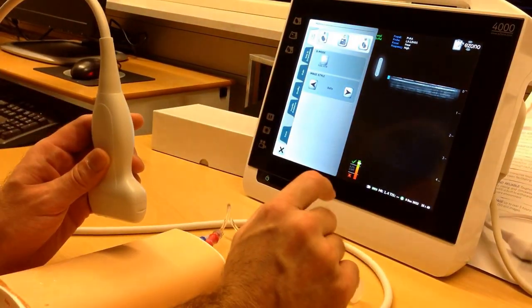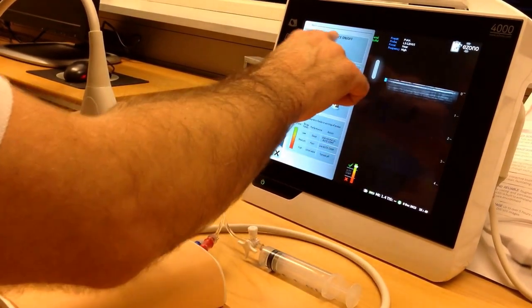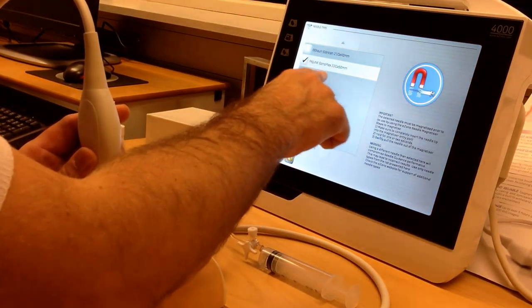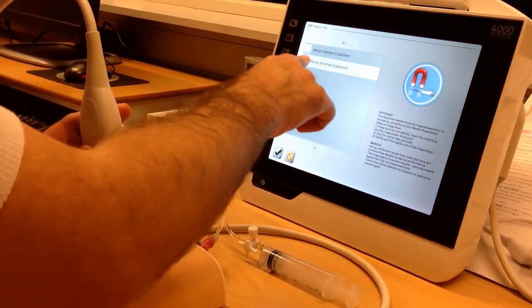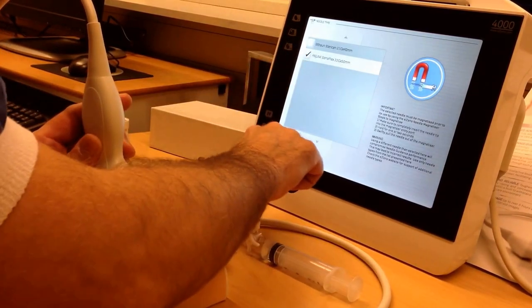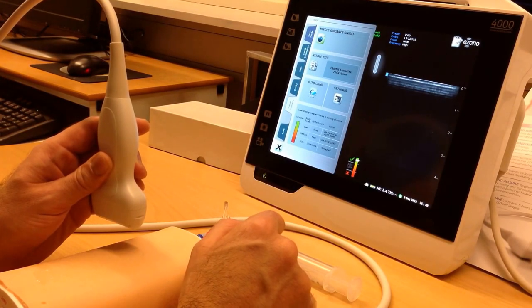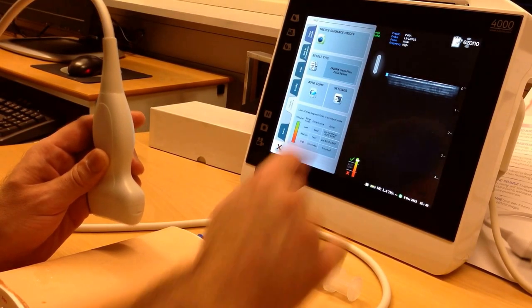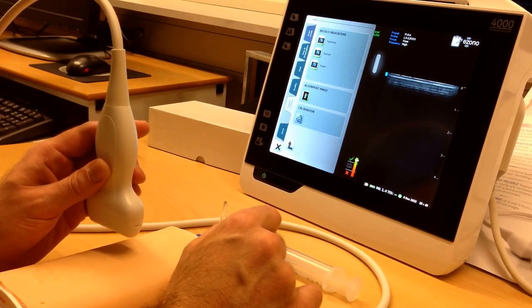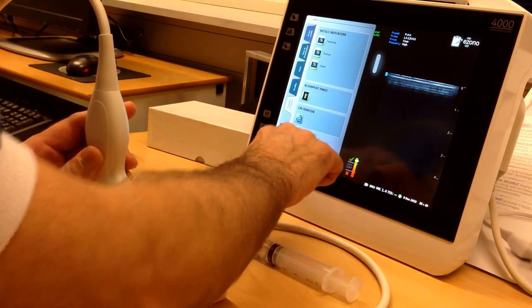The next thing I want to do is be sure that the needle guidance system is turned on and that I've chosen the right needle. Here you can choose between different models of needles — you have to find out which one you're going to use for this procedure. Under settings you have the possibility to calibrate the probe. I've done this already and I'm on the green field down here, so I'm happy for the moment.